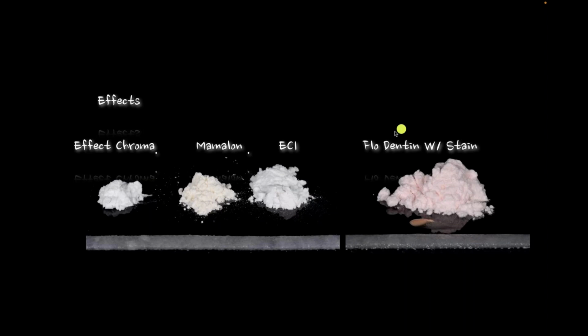Sometimes I find that I'm actually mixing in. Maybe I want a fluorescent dentin and I'm going to mix in a little dot of a salmony kind of a stain, or I'm going to use a colored mamelon material and mix in a little dot of a white stain. Because what I'm really trying to figure out is what's going to work best to replicate what I'm seeing in that one tooth. Again, I wish I could tell you this is such a simple formula.